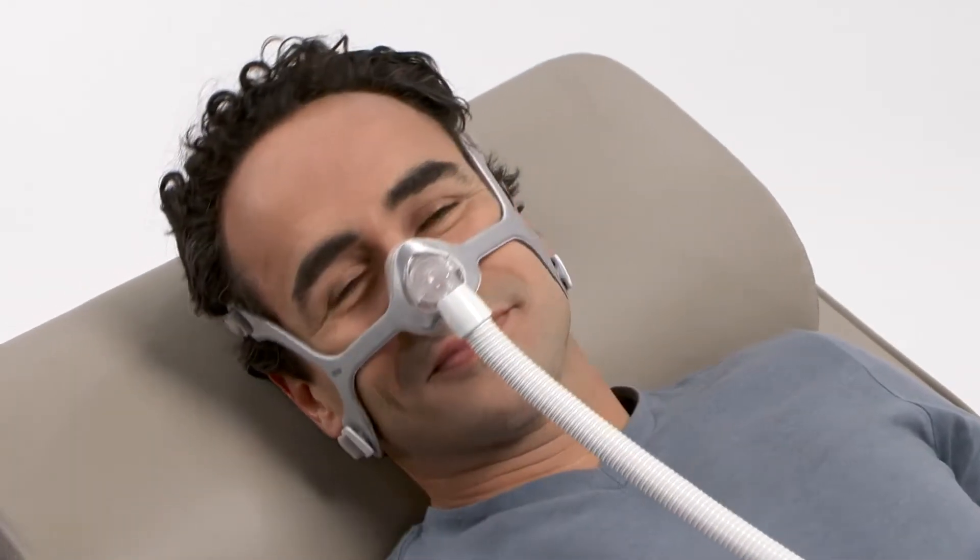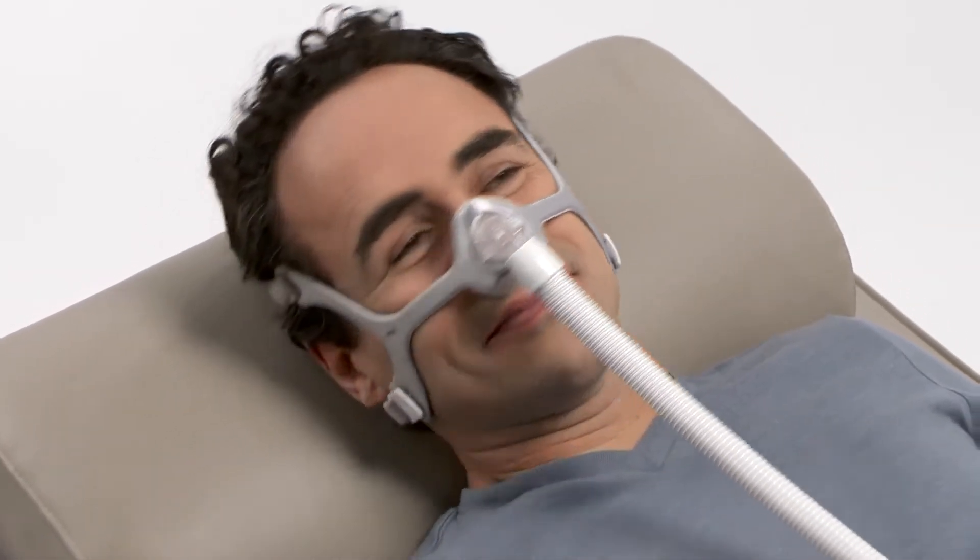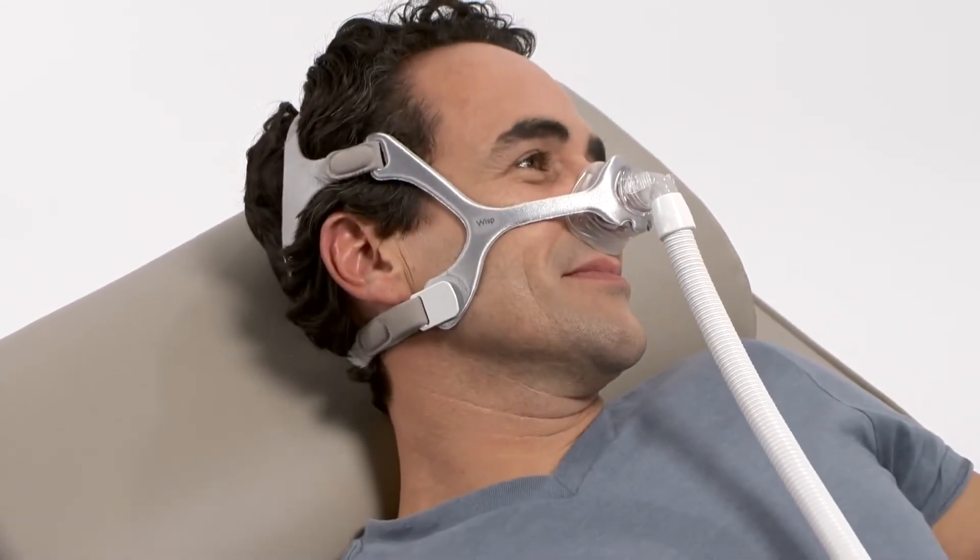With your air pressure at the prescribed level, turn your head from side to side and identify the areas of leak.